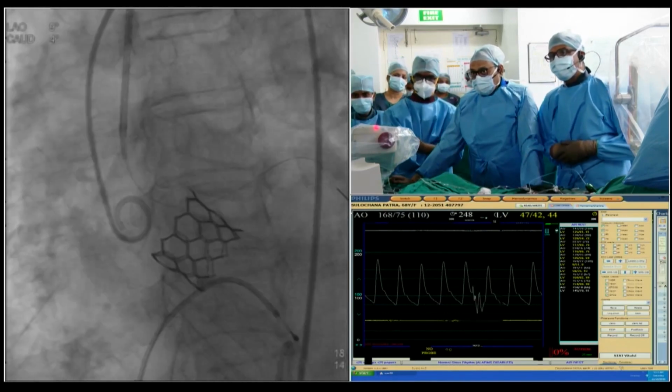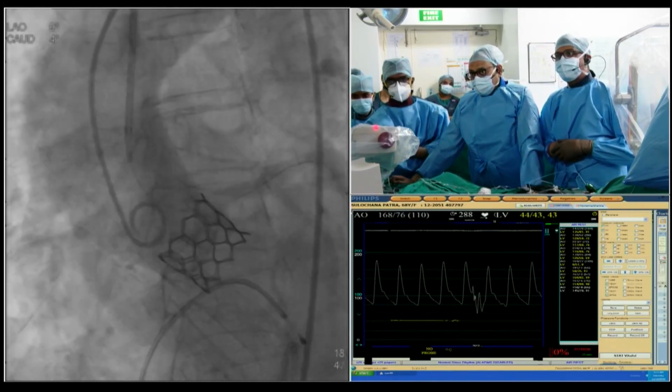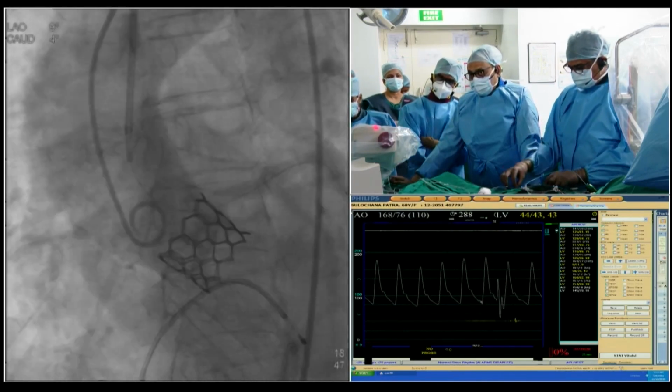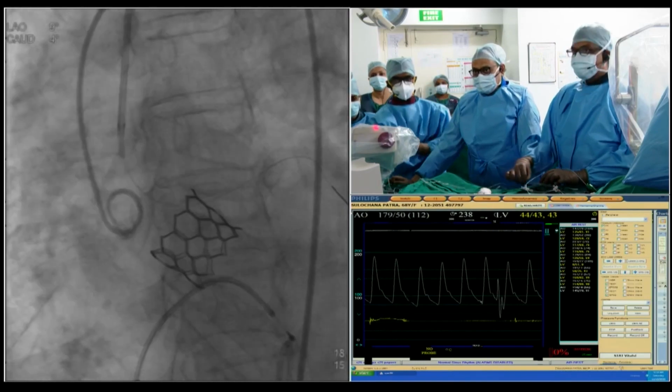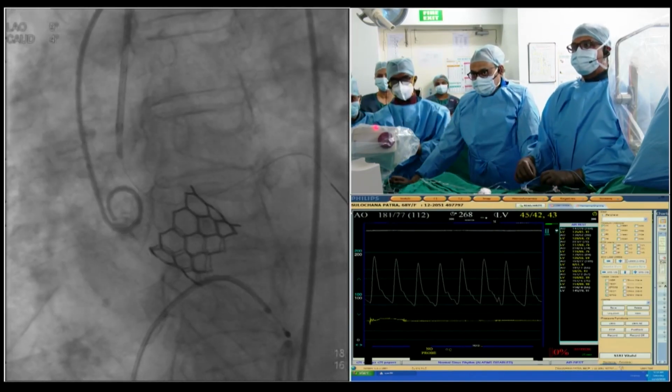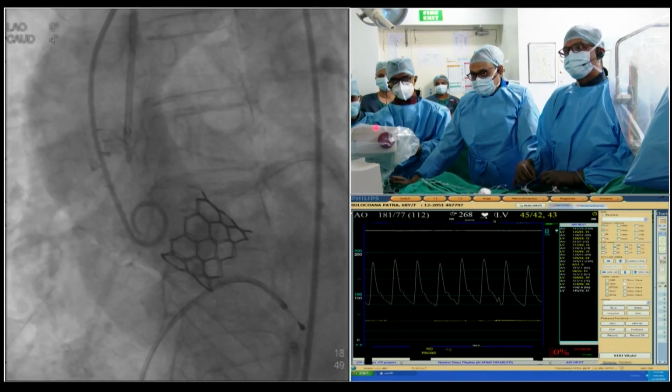Okay, that is true. This is just to show there's no AI. So I think now the house is divided here. Earlier, everybody was gung ho that the case is over and done. That's better. But I think with all this that we have seen, we are open to your putting in a stent in the left main. Amit is coming back.